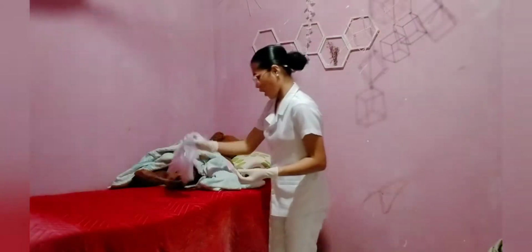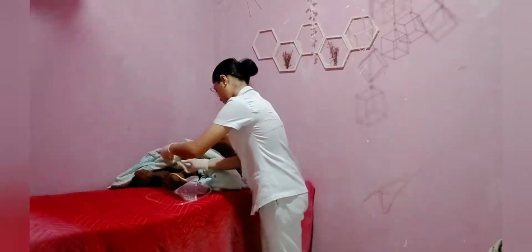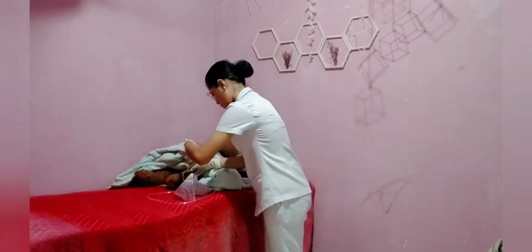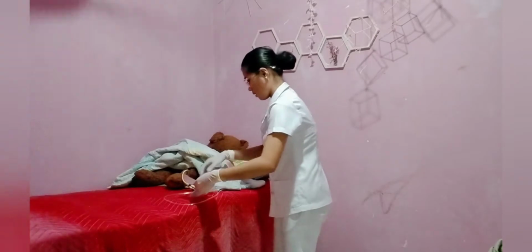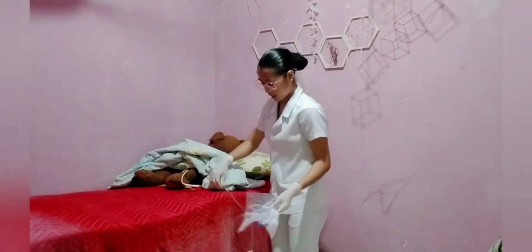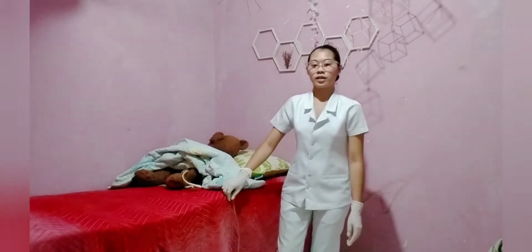So, I will take it here. Then place the urine bag in the dependent area.